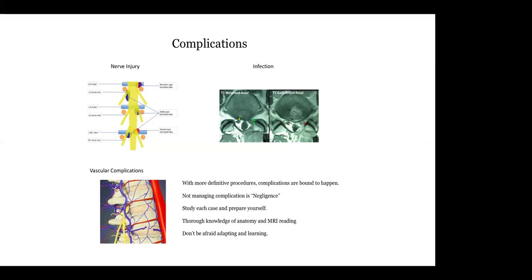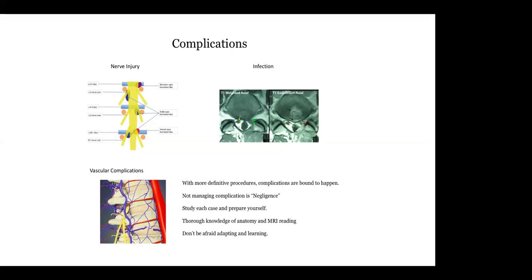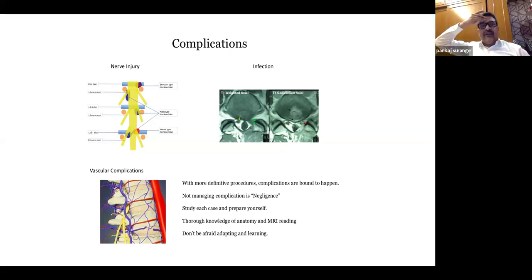Sir, transiliac is necessary when we wish to do fusion endoscopically in MIS, that is endoscopic TLIF cases. So fusion is okay, but at a time the surgeon or physician must know how we should do it. Fusion is a different issue.